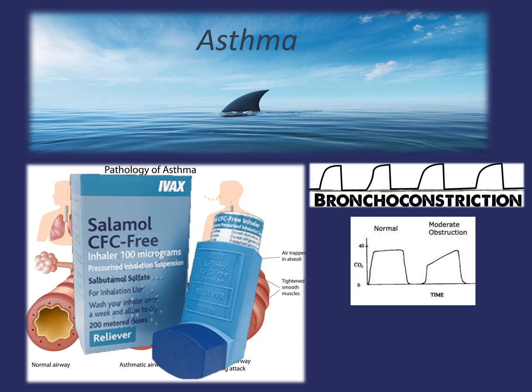For the asthmatic patient, what medications are we administering? Well, bronchodilators. So after administering the medication, we'll be able to appreciate not only by the patient's clinical improvement, but now also the waveform capnography. You'll observe that shark fin returning to a normal waveform, and we'll see that plateau returning. It helps us see if our patient is improving or if we need to start thinking about moving toward other modalities of managing this patient's bronchospasm. Epi, steroids, magnesium, CPAP. So this is a VQ mismatch caused by respiratory.